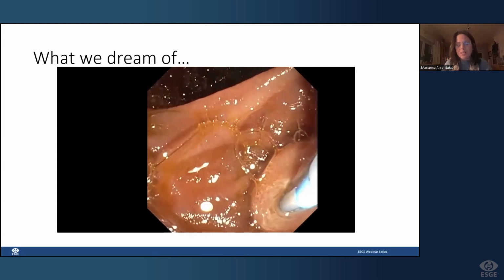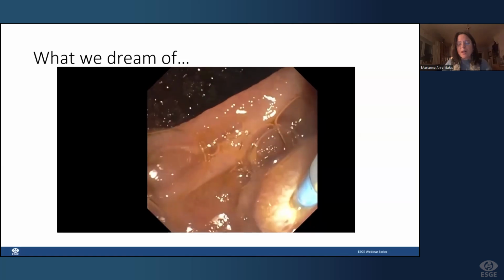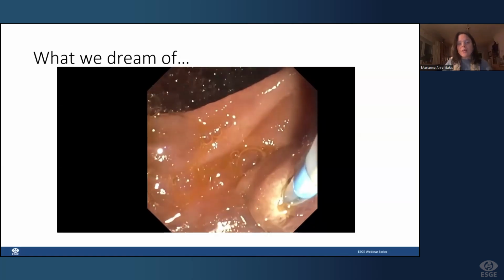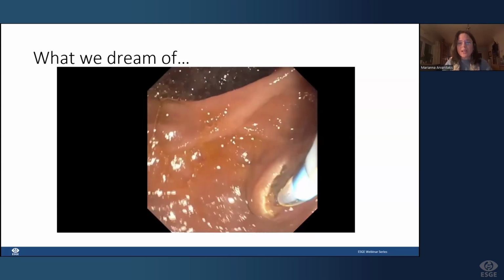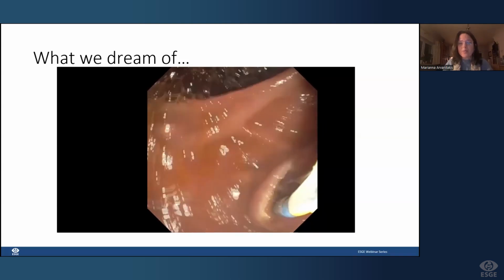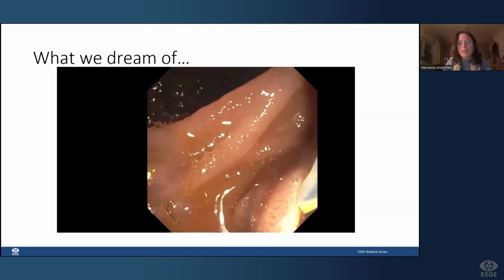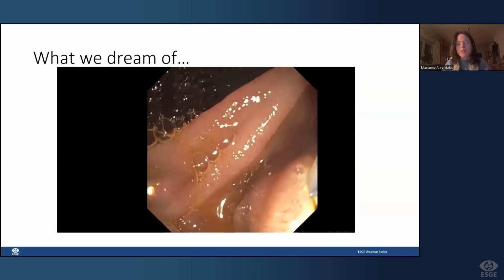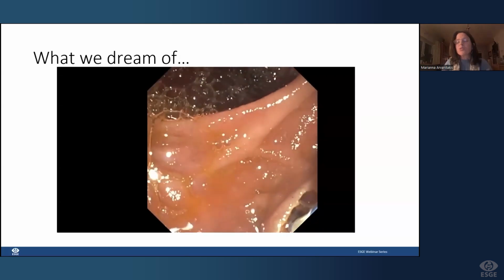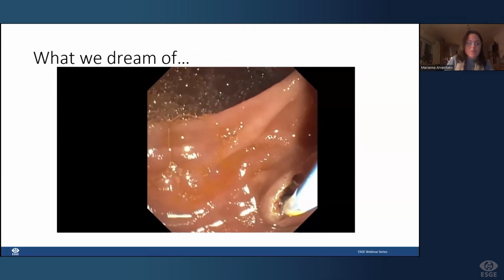We will inject to confirm, and then we will do a sphincterotomy by using our right hand on the scope to give the direction, good solid direction, again towards 11 o'clock in the biliary direction, and we will also get the landmarks we need, really establish the landmarks to have a complete sphincterotomy, depending, of course, on what we need to do. But if we want to take out some stones, of course, we need a complete sphincterotomy.